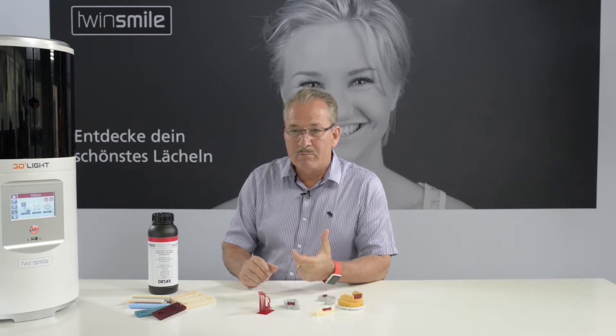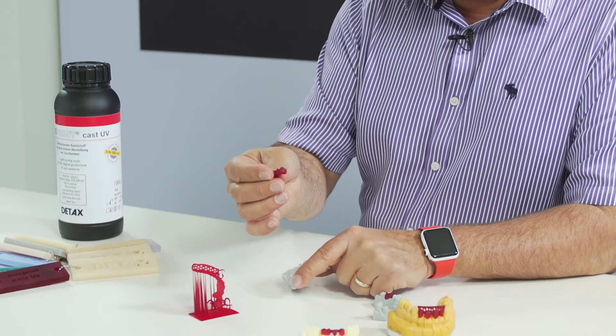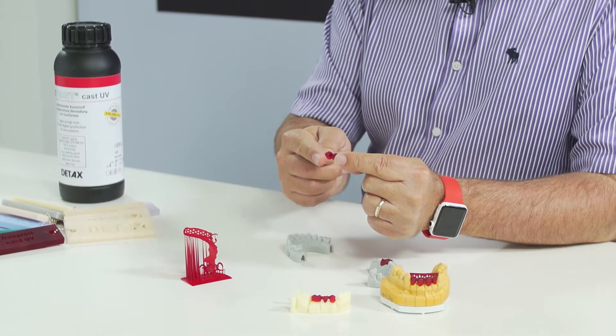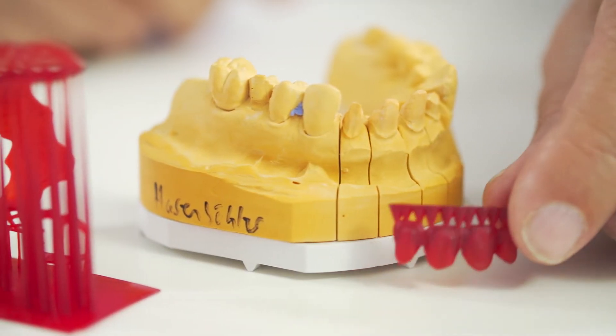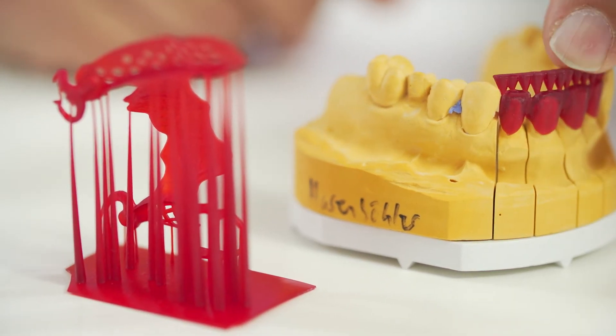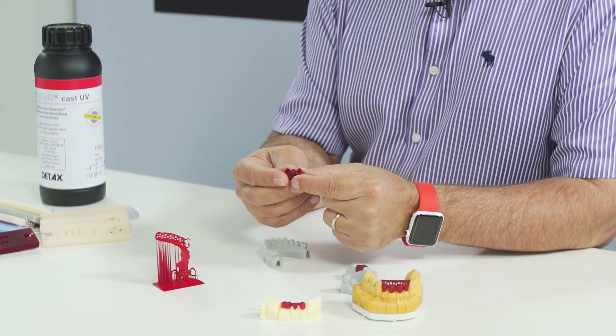Castings are still a big part of our daily business. For printing casting parts we use a liquid called Cast UV. In the early days we used to wax up things, but nowadays we design it on screen and print it — like you see here, you just put your supports in, invest it, and basically cast it.